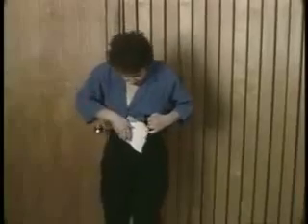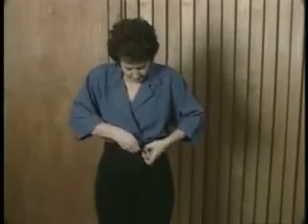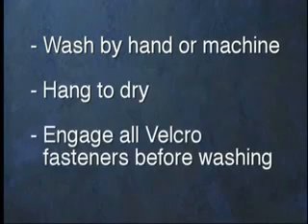Patients may take their Dale binders home for continued benefits both during and after recovery. It fits inconspicuously under clothing to provide comfortable support as normal activity resumes. The binder may be gently washed by hand or machine with a mild detergent and air-dried, but be sure to engage the Velcro surfaces completely before laundering.